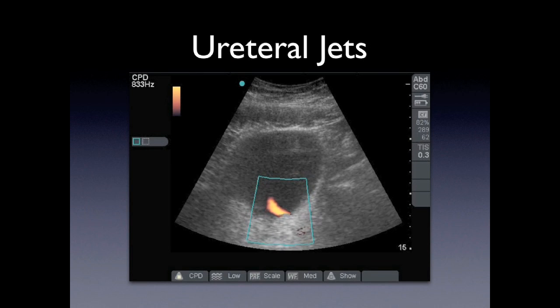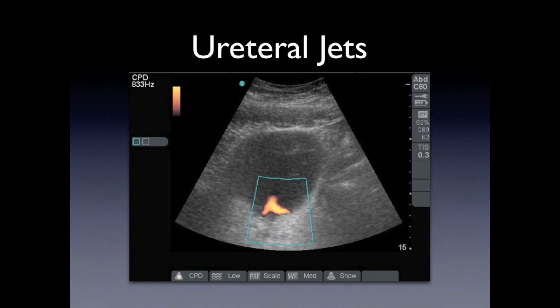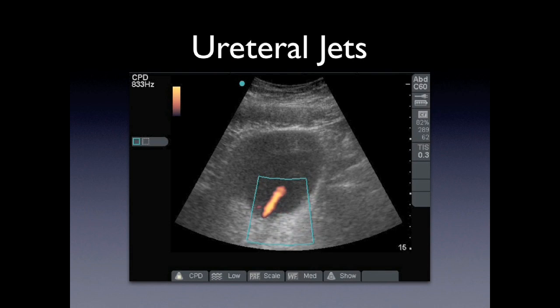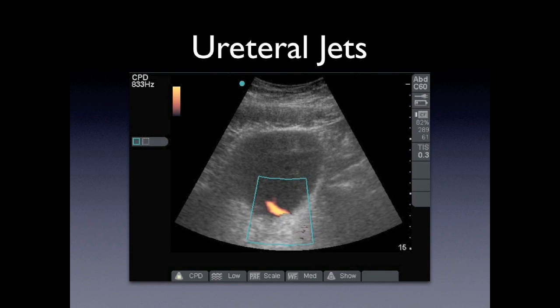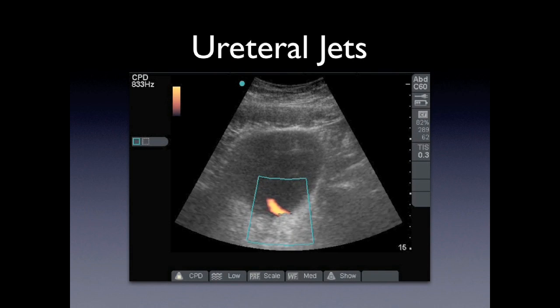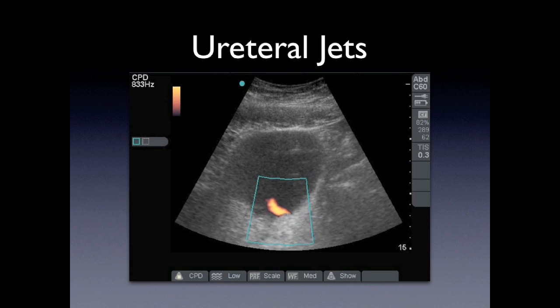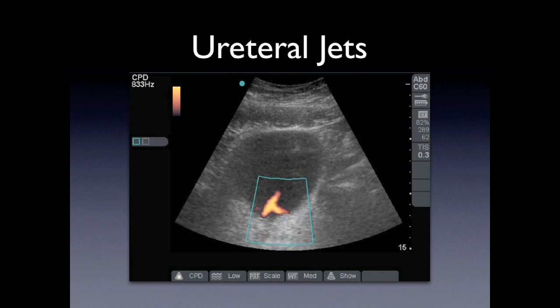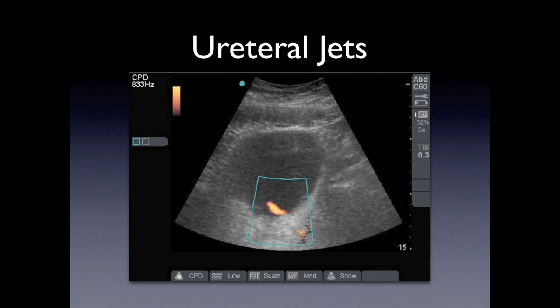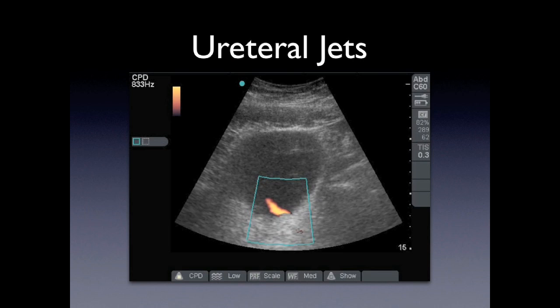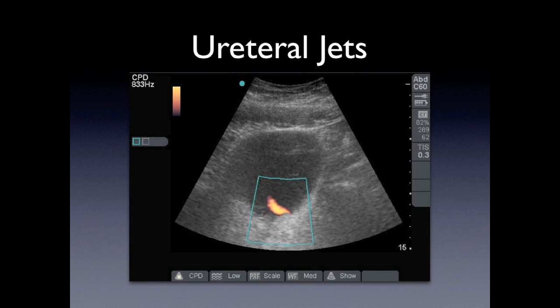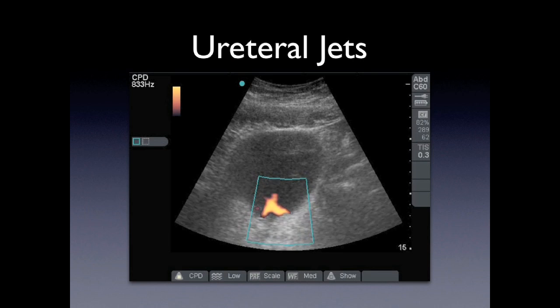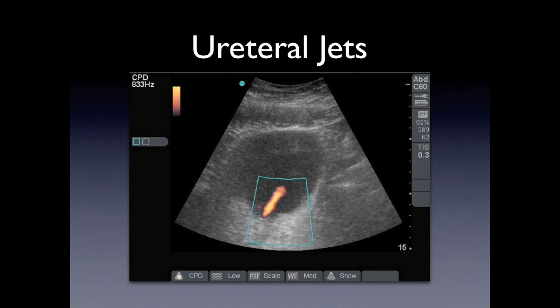Here we see ureteral jets — this is flow from both sides of the ureters into the bladder. You see the left one and the right one, indicating that there's good flow from the kidneys. If you do have an obstruction, you're going to be missing these jets.